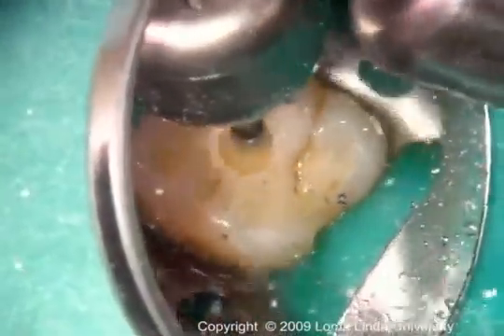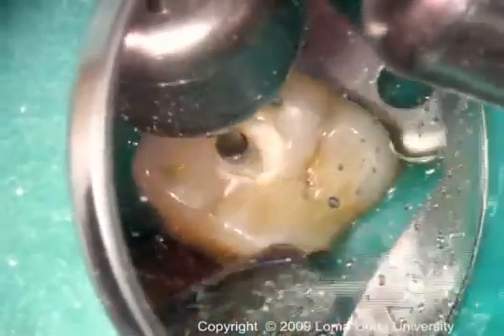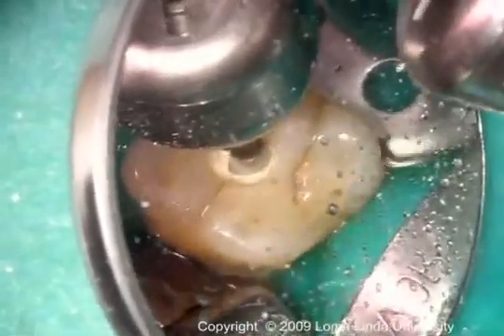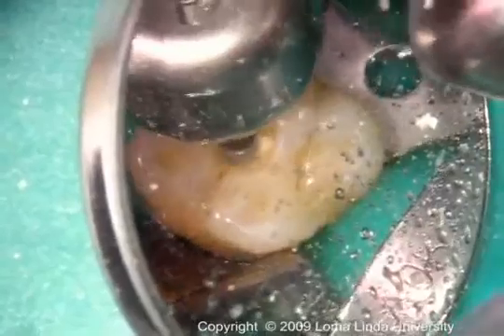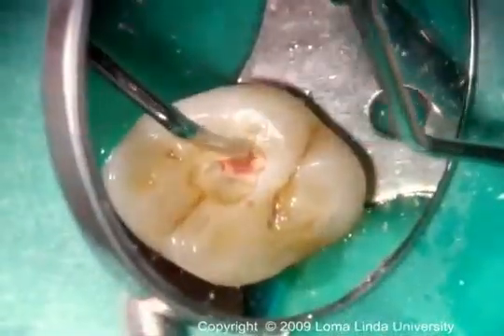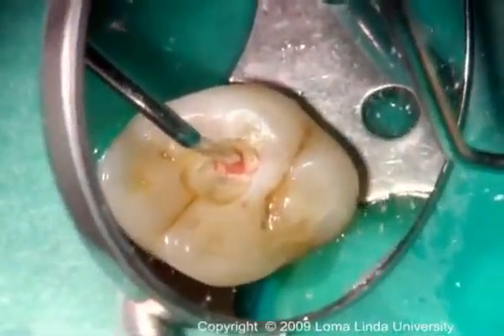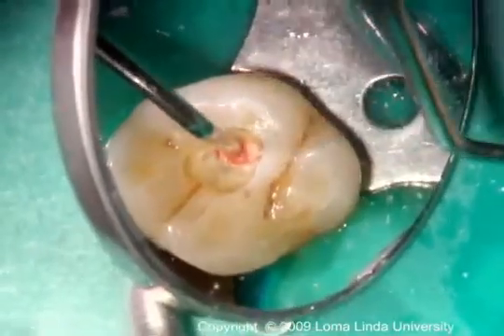The axis preparation into enamel is made with a number 4 or number 6 round burr in the center of the crown and parallel with the long axis of the tooth. The pulp chamber is located by using an endodontic explorer.